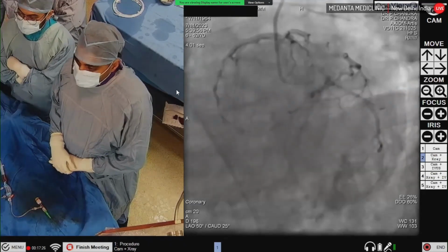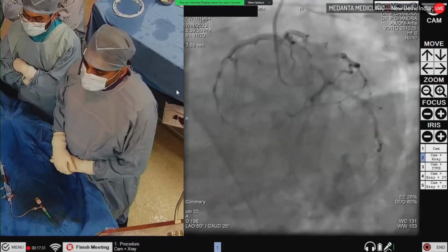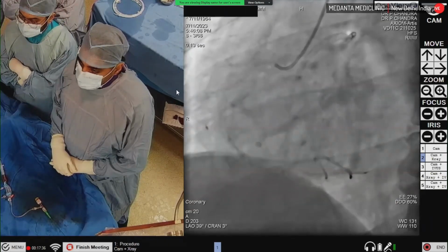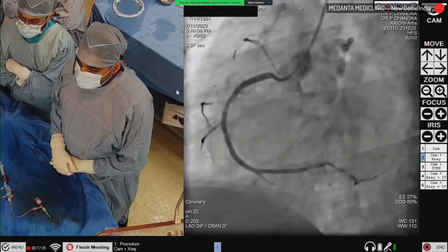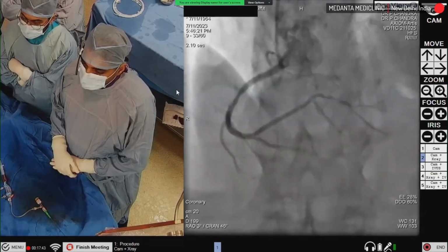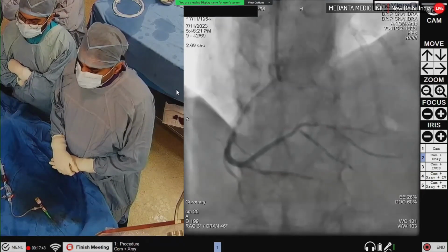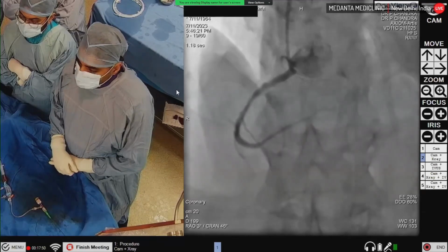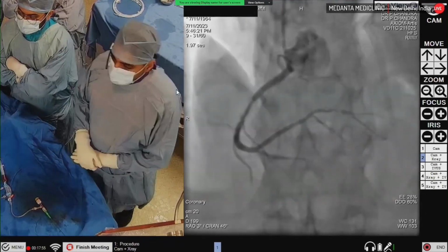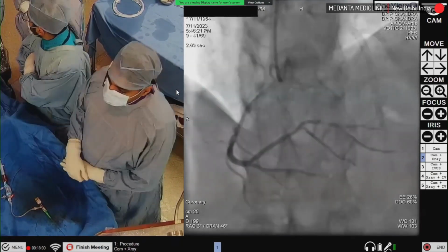Circ is a very small vessel, having an 80% stenosis in the mid part. And the main lesion was in RCA. Next please. So this was the RCA lesion. In between, at the midpoint, there is ruptured plaque with a thrombus inside, and the distal PD is also having some thrombus. PLV is also having mid approximately 70 to 80% disease. So our plan was to again anticoagulate for the next 1 to 2 days, and then we'll plan for stenting to this RCA.